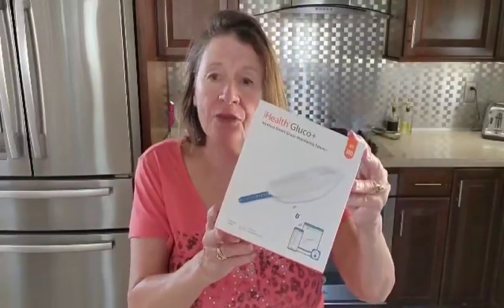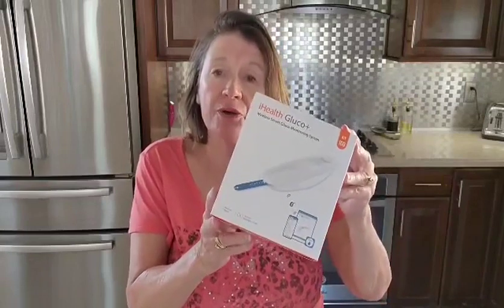Hi everyone, Julie here. Today we are looking into the iHealth Glucose Monitor.